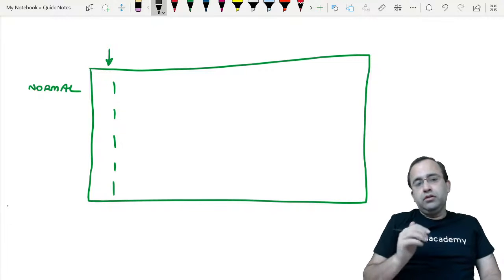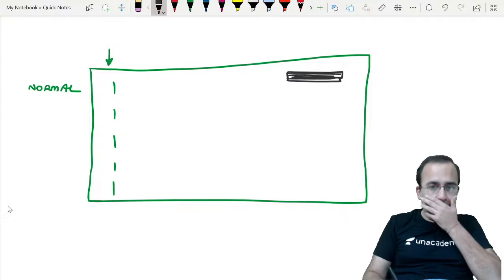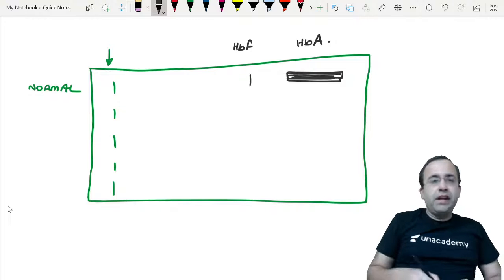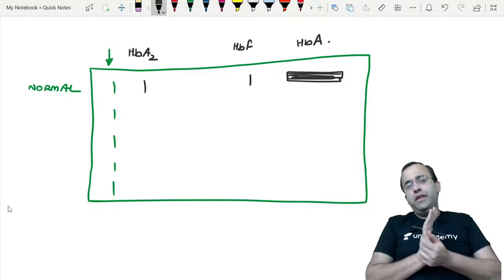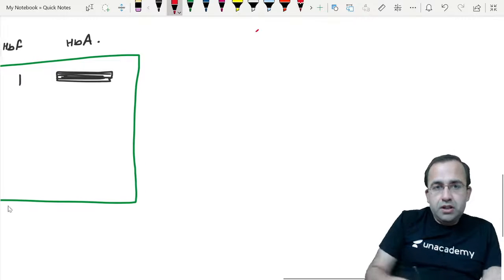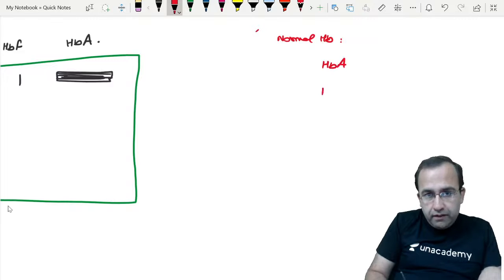What do you see here? Normally, we see the thickest band of HbA farthest from the point of origin, followed by HbF, which is close to HbA, and HbA2, which is closest to the point of origin. This is normal. You know the normal percentages of hemoglobins. Before we go further, tell me, normal hemoglobins in adults, there are three main: HbA, HbA2 and HbF.